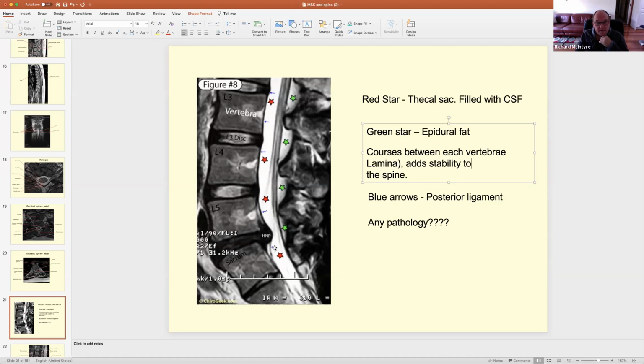You can also see that this is a T2 weighted scan, and the disc here is very bright. That means it's wet fluid and it's able to take the cushioning from the vertebrae, okay, which is good. Out here, it's not so wet, it's dry. And certainly down here, where there's injury, it's lost, it's called desiccated. So it's become dry and it's lost its compression, okay? And as such, it's dry and it's herniated the disc out into the spinal cord, which is going to cause a lot of pain.